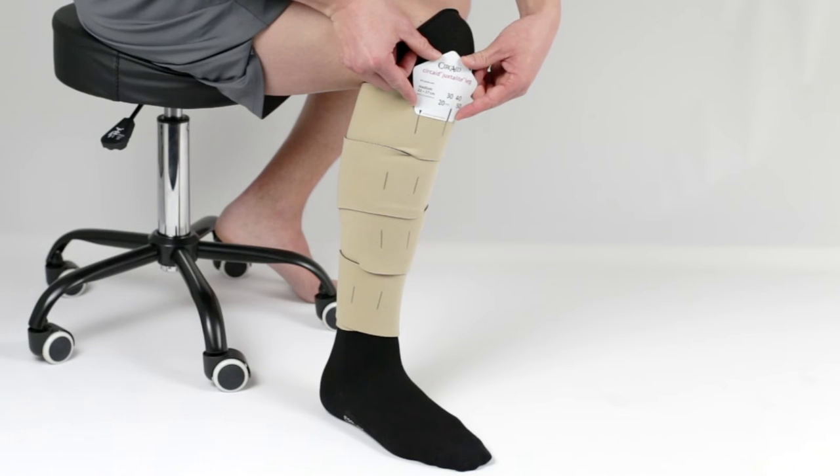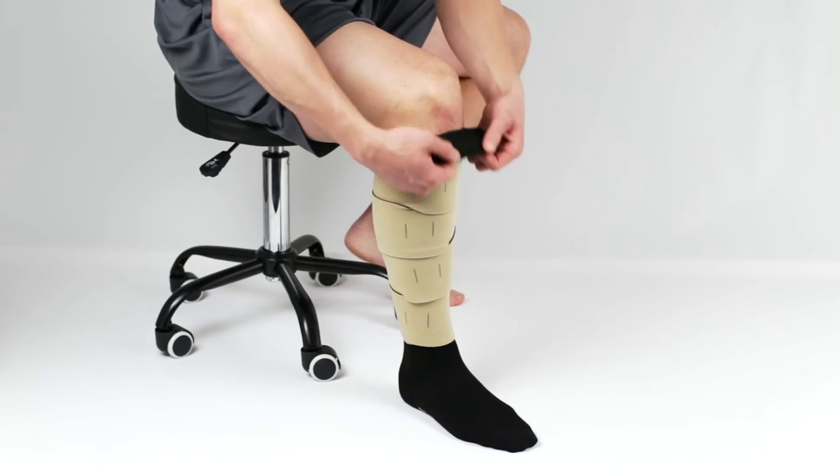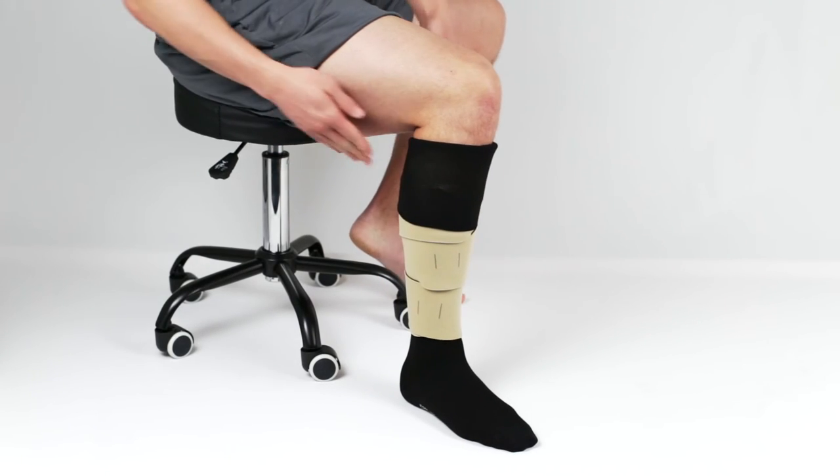Once the correct pressure is set using the BPS cards, you may fold the top part of the CircAid Compressive Undersock over the top of the CircAid JuxtaLite garment. Ensure that there are no wrinkles in the garment.